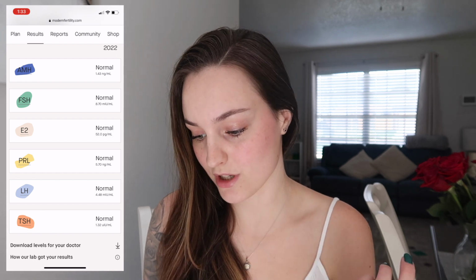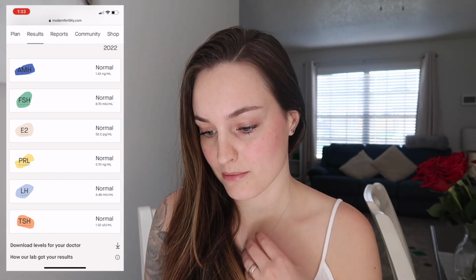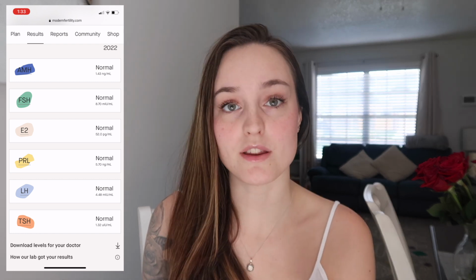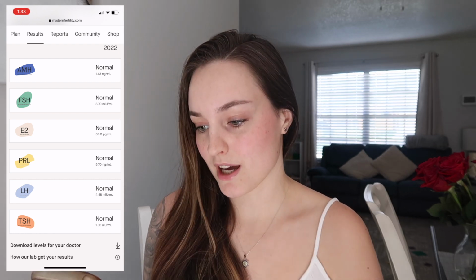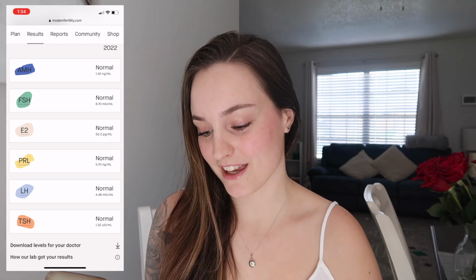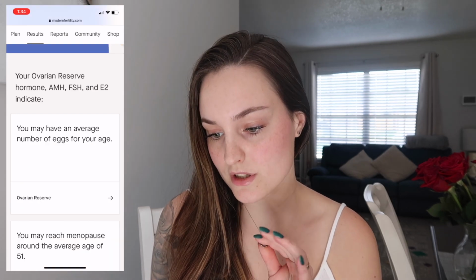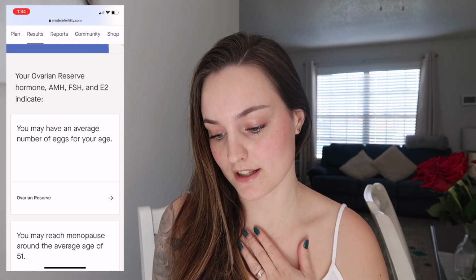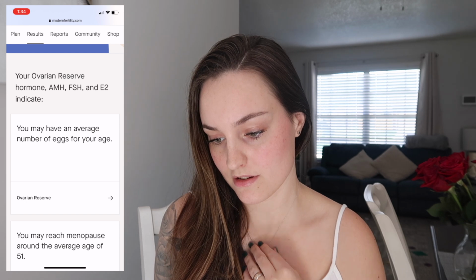Oh, I know LH is luteinizing hormone, which is to do with ovulation, but apart from that, not really sure what any of the other ones mean. So let's scroll down, but that's a good sign, they're all normal, thank goodness. Ovarian reserve hormones indicate that you may have an average number of eggs for your age, so that's good. Let's click on ovarian reserve.